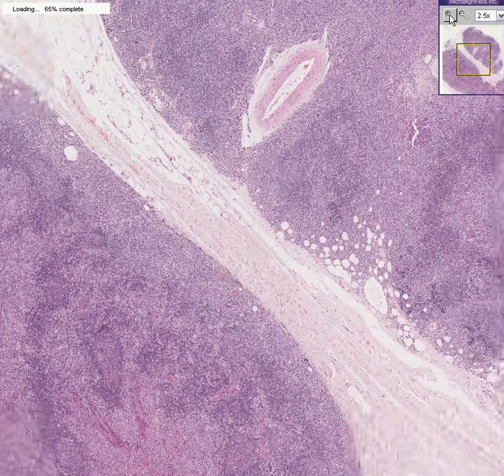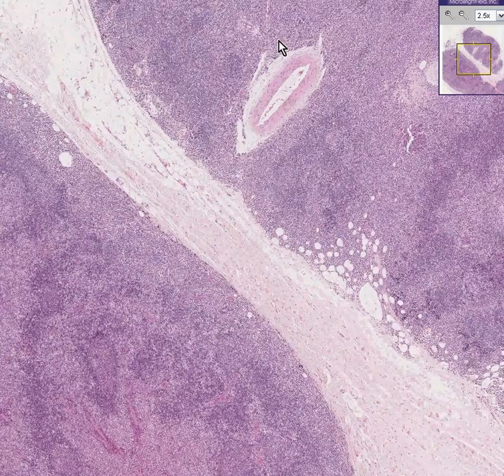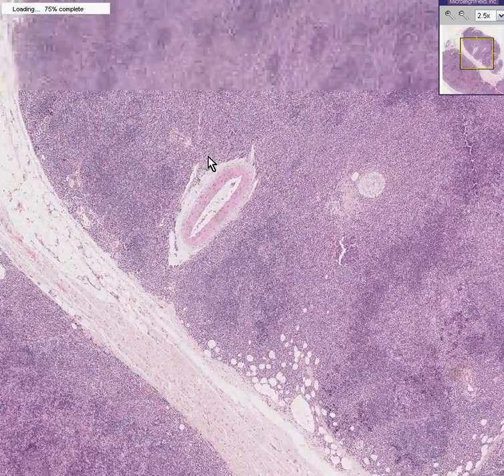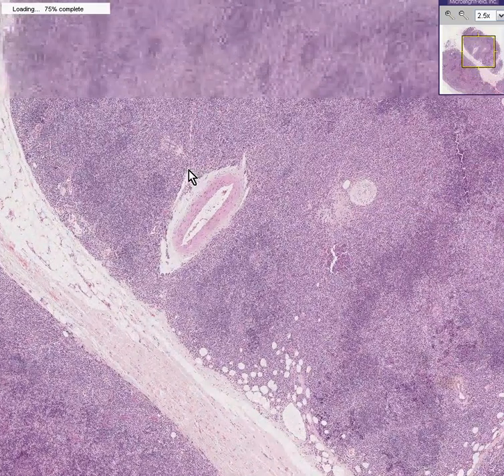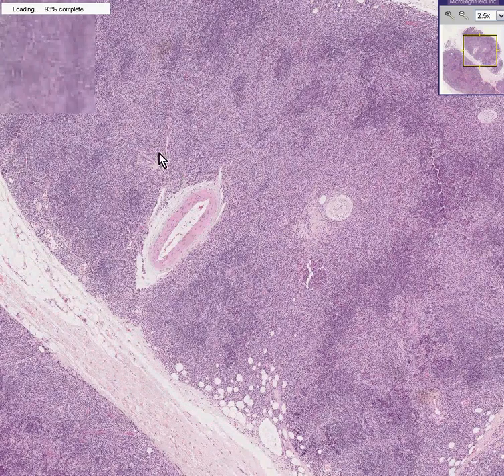I could stop here, and I probably should, although I wanted to explain to you why this one happens to be called a marginal zone B cell lymphoma.